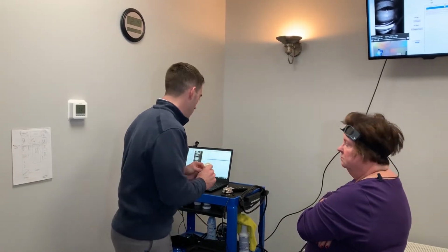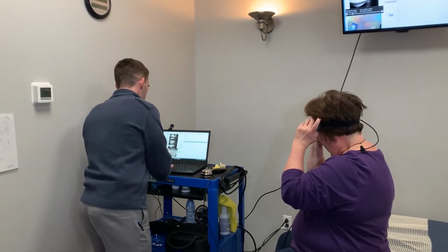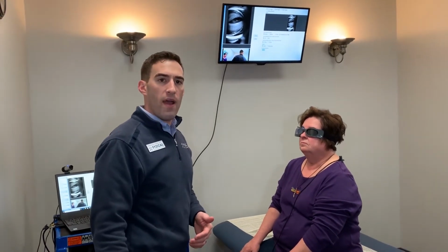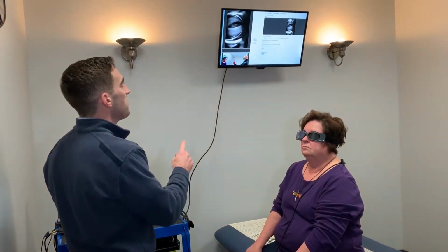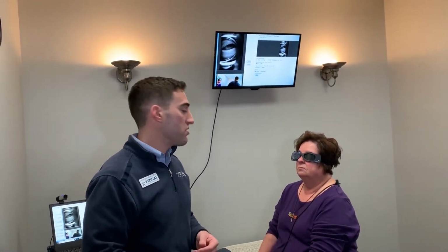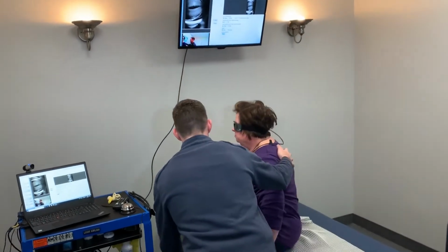Okay? So I'm going to have you go ahead and slip those goggles back on over your head that way. Everything's in order here. So the purpose of these goggles is if people have vertigo for a while, they get what's called accommodation, so their eyes no longer move in the light. So we can see her eyes, and she can't see any light right now. And what that does is it kind of fools the brain into allowing the eyes to move so that we more accurately know what's going on.